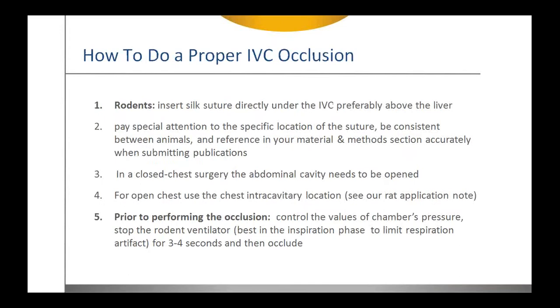Okay, moving forward, how to do a proper IVC occlusion. In rodents, as compared to large animals, please insert the silk suture directly under the IVC, preferably above the liver.